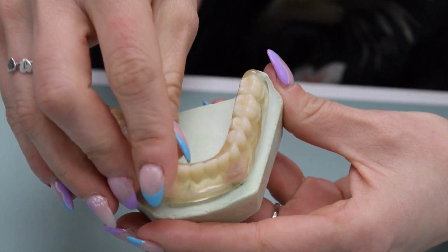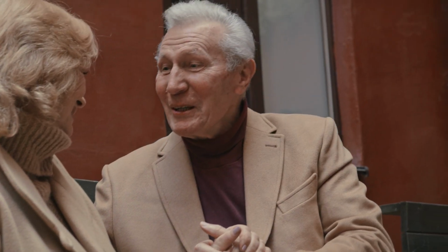In order to do that, in either an upper jaw or a lower jaw, you would usually place anywhere from 2 to 4 implants into that jaw, and then the denture can snap onto and snap off of those implants. One of the upsides to a snap-on is that typically they stay in place when you're having natural, normal conversations, whereas denture wearers are always a little bit worried that the denture might dislodge or fall down while they're talking or laughing. Well, the limitation here is that there's only so much snap-on force that can be applied.